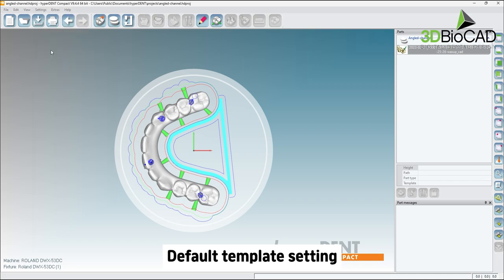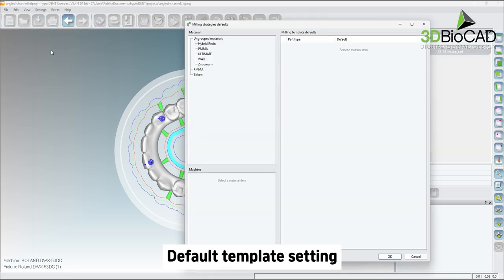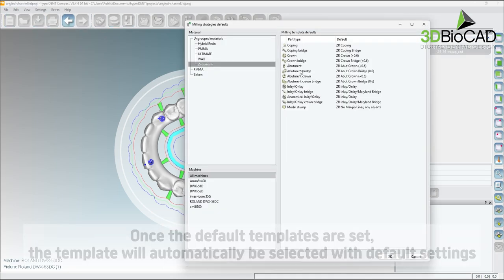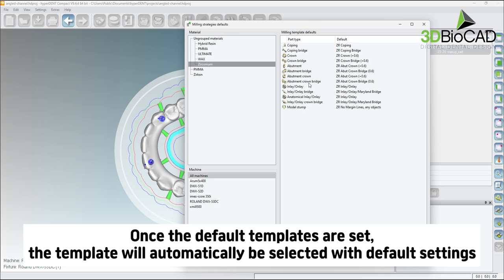We will now select the template by selecting settings, then milling strategies defaults. Choose material and restoration type. The template chosen will be set as a default for the next job.